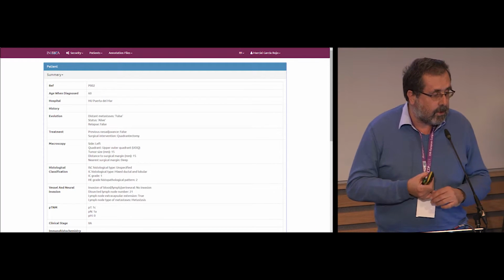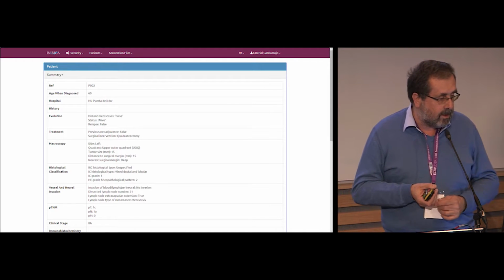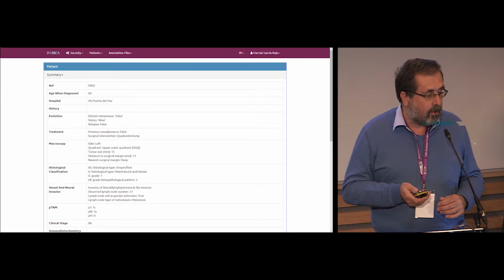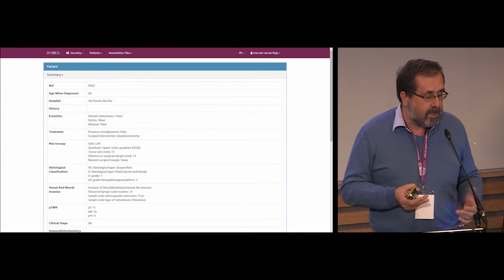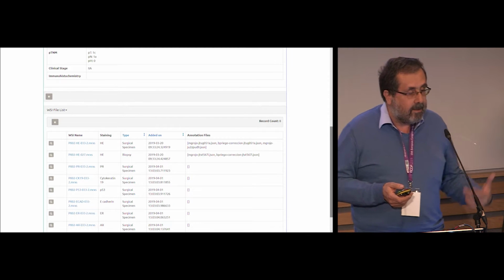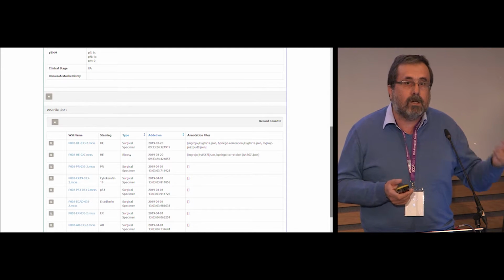On all cases, of course, we've got anonymous information, but all the clinical data, including the treatment, including staging, including pathological findings, and so on, so that it is very easy to correlate what we are reviewing during our annotations with also the clinical and the pathological data. Additionally, we also have immunohistochemistry, which also helps us a lot when we are trying to do annotations.